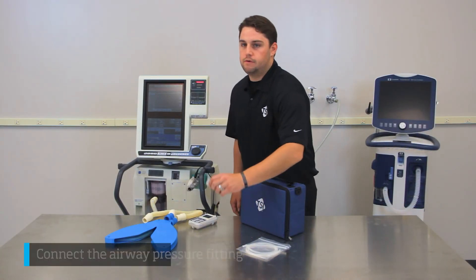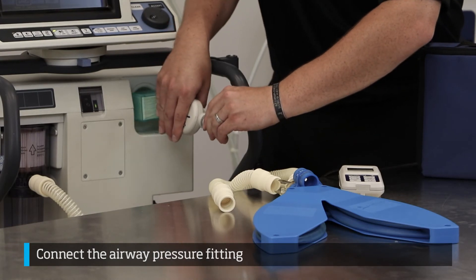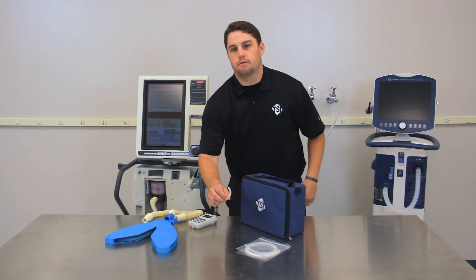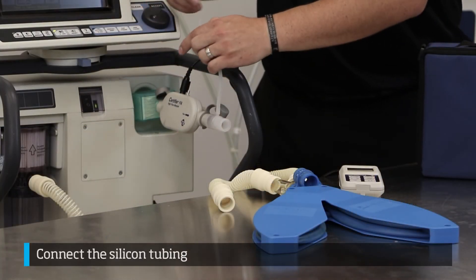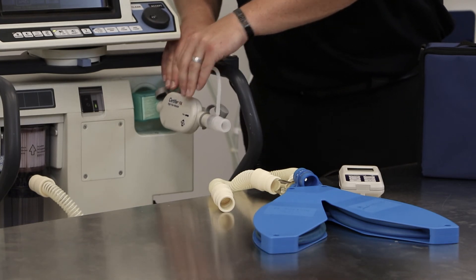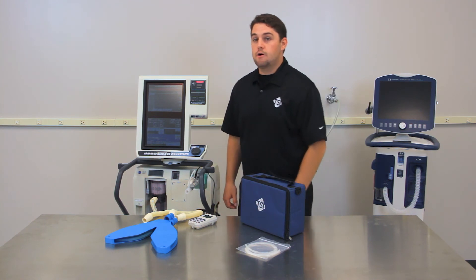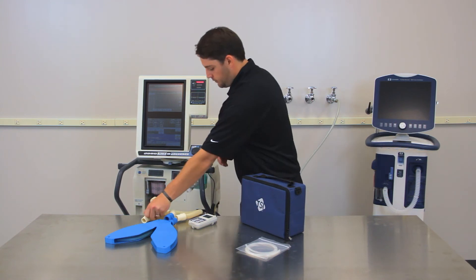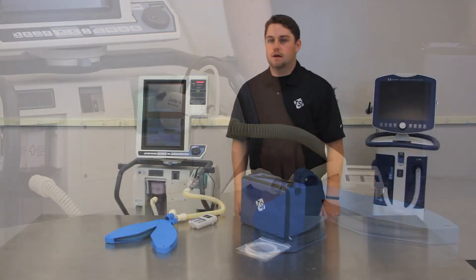Now place the airway pressure fitting — the one with the screen inside — on the open end of the flow module. Then take the silicone tubing provided, and slide one end onto the pressure port on the airway pressure fitting with screen, and the other end onto the pressure port on the high flow module. Connect the inspiratory tubing to the end of the airway pressure fitting. The filter, high flow module, and airway pressure fitting should now all be in line with the inspiratory side of the ventilator.